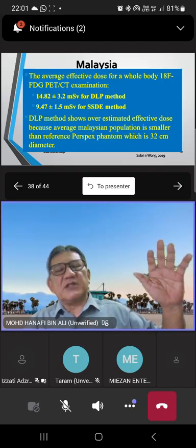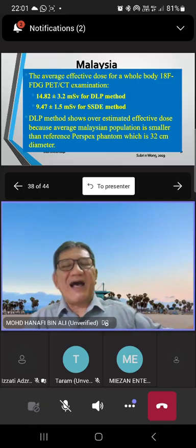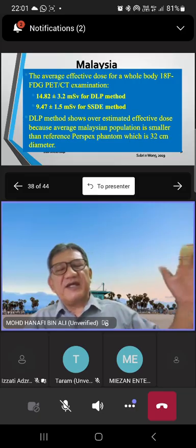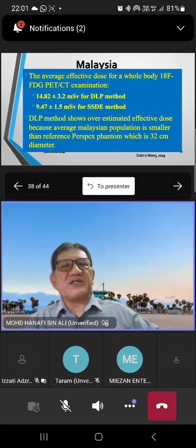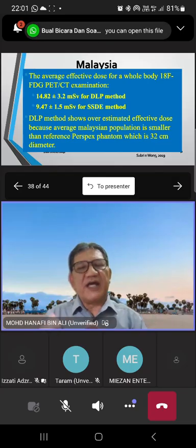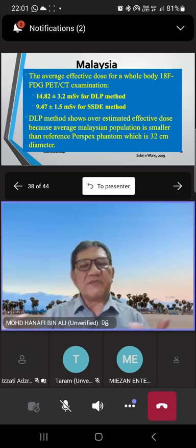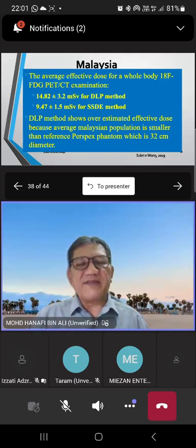Let's say in Europe they use 120 kVp, we might use 100 kVp. They use about 400 mAs, we just use about 300 mAs. We reduce the dose to get the same quality of image. Yeah, so that's still something we can improve a lot with this new approach.